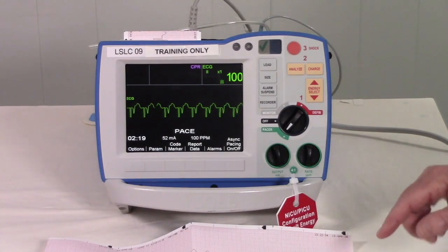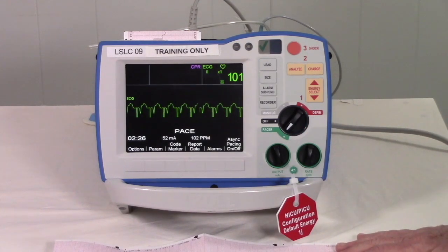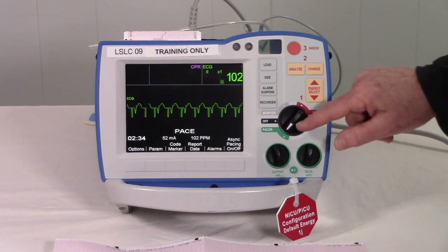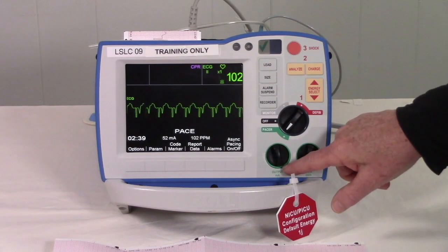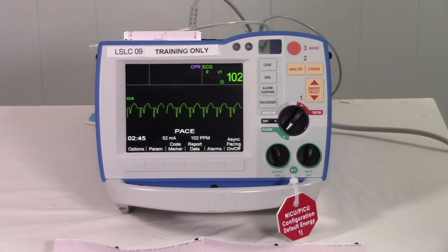If you need to change the rate, you can do so at any time. In review, for pacing with the Zoll R-Series: the patient needs pads and leads, turn it to pace, set your rate, and increase output until you have good electrical capture. Once you do, check for good mechanical capture and improvement of patient condition.